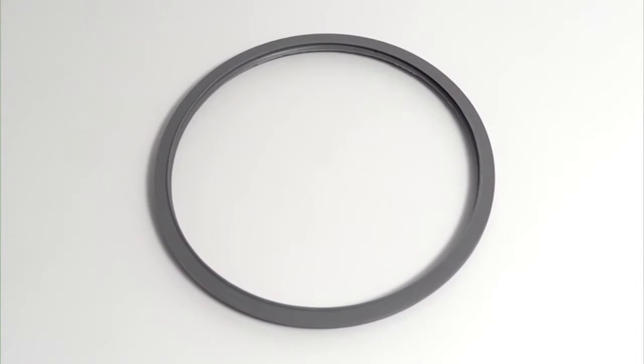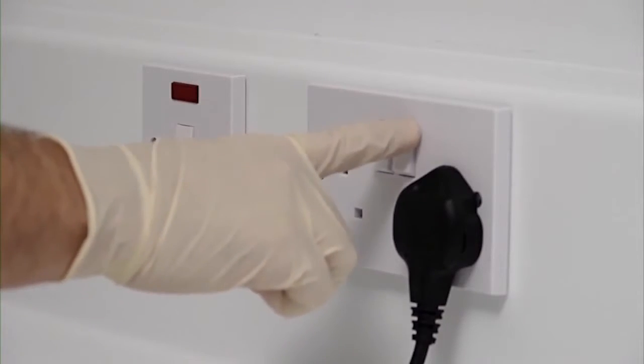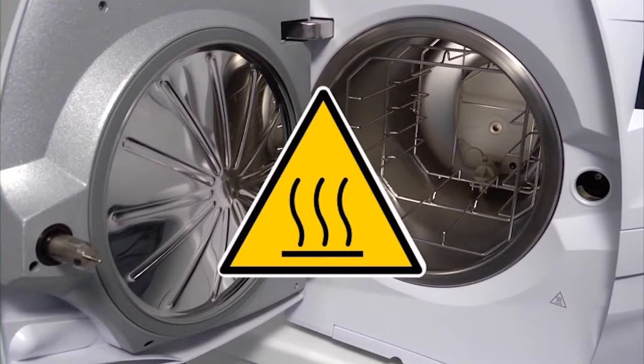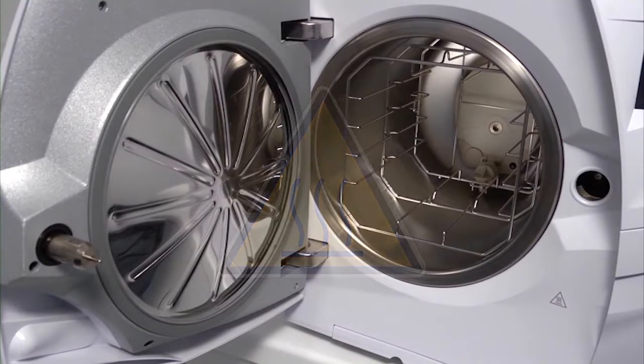There are no special tools required to complete a door seal change. This can be carried out by the operator. Ensure the steriliser is switched off and the power supply is disconnected. Be aware that your Lisa steriliser preheats the sterilisation chamber and that all surfaces in contact with the chamber may be hot. The steriliser should therefore be left to cool until the surfaces are safe to touch.